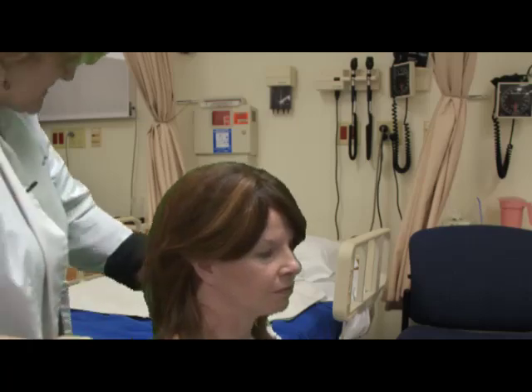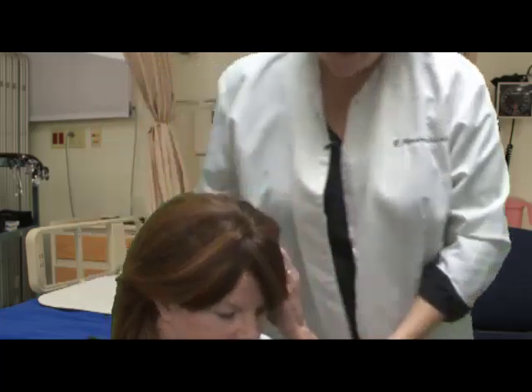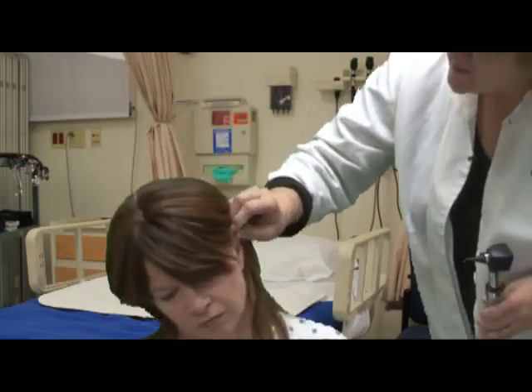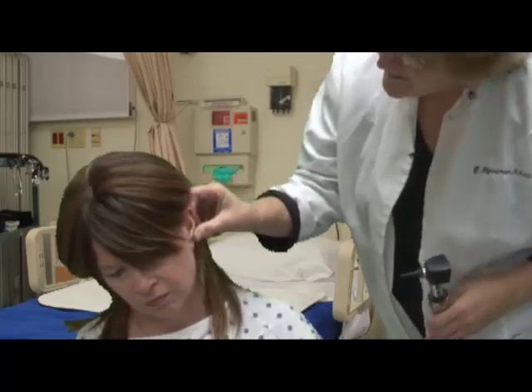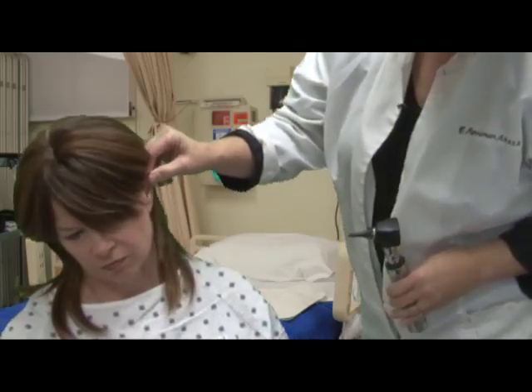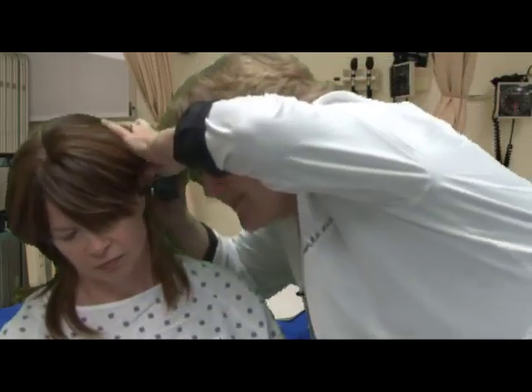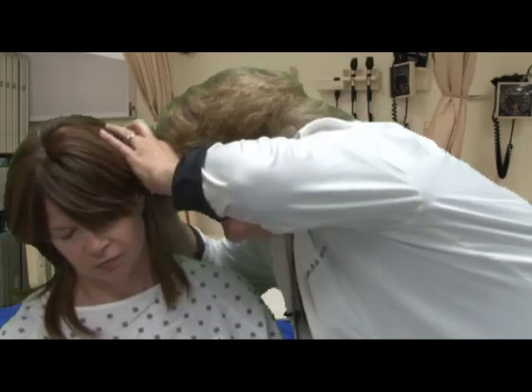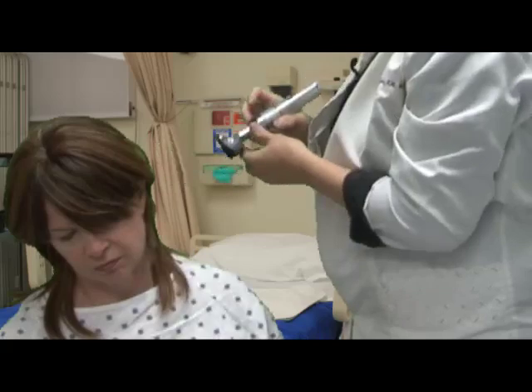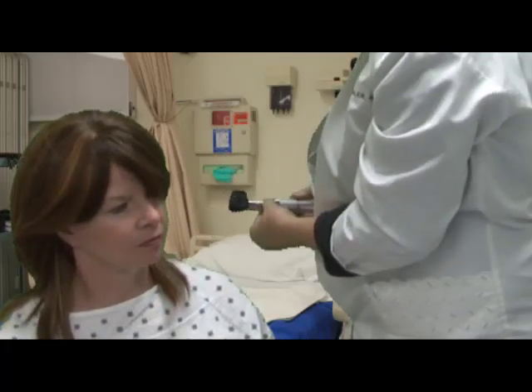Then I inspect the left ear. No visible problems, no swelling on the external ear. I pull it up and back — no pain — and insert the scope. I see a tympanic membrane. In the left ear the cone of light is at the seven o'clock spot.